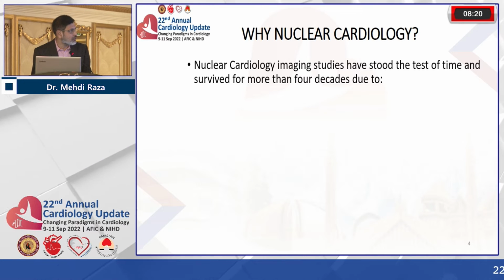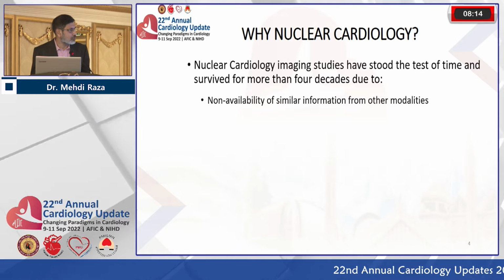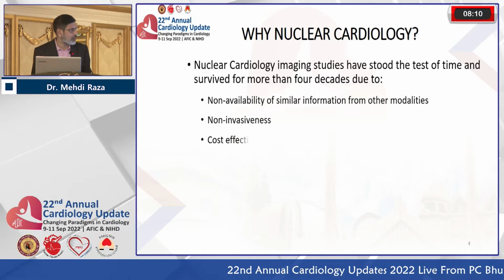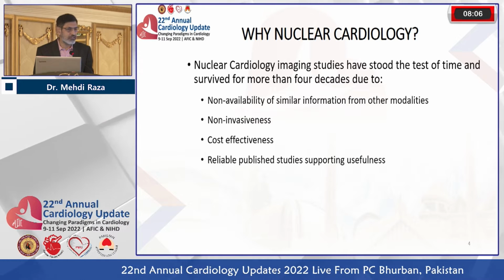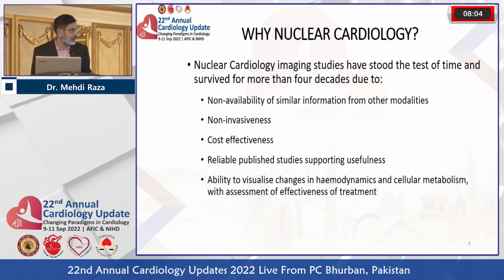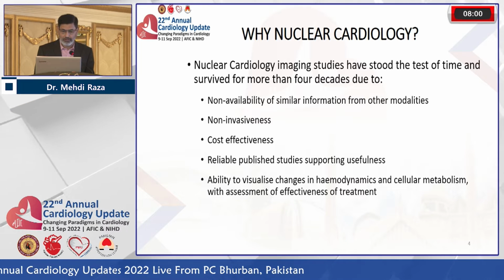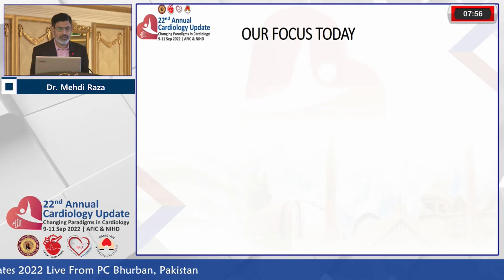Now, why nuclear cardiology? The imaging studies have stood the test of time and survived for more than 4 decades due to non-availability of similar information from other modalities, non-invasiveness, cost-effectiveness, reliable published studies supporting usefulness, and ability to visualize changes in hemodynamics and cellular metabolism with assessment of effectiveness of treatment.